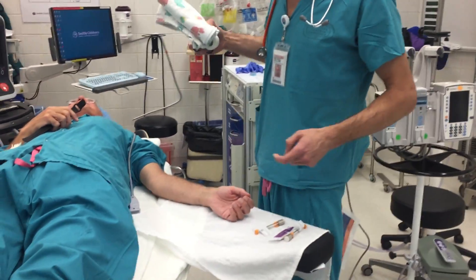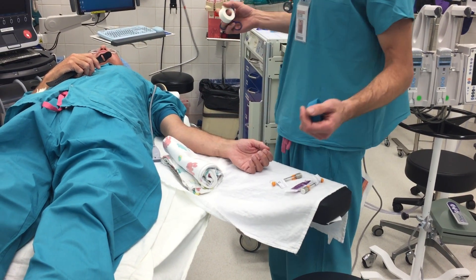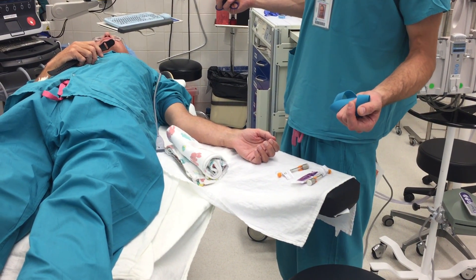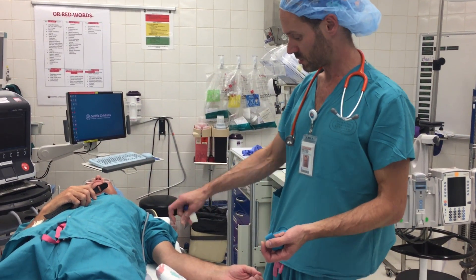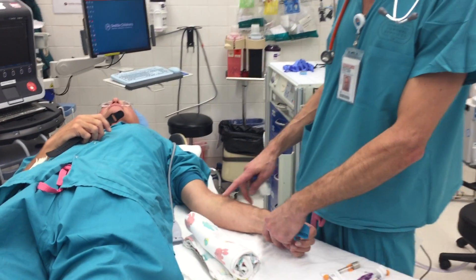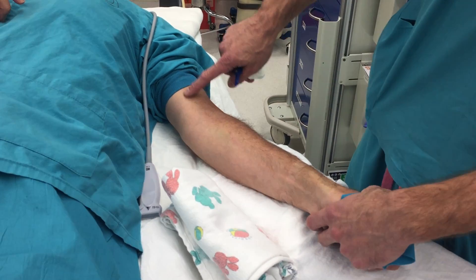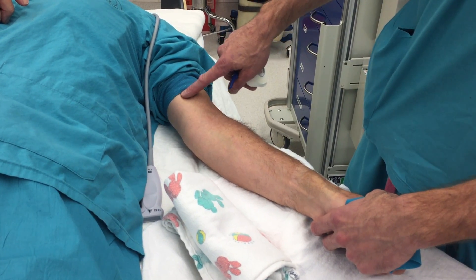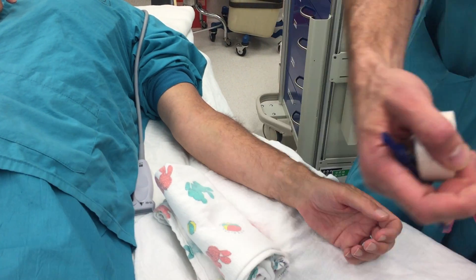The second thing is selecting a good vein. To do the in-plane technique, you need to know that the vein you're selecting runs in straight lines. I choose the veins in the forearm below the cubital fossa, or the cephalic vein at the wrist, or if I'm looking for a bigger IV, sometimes above the cubital fossa. Usually here or here, or the saphenous.